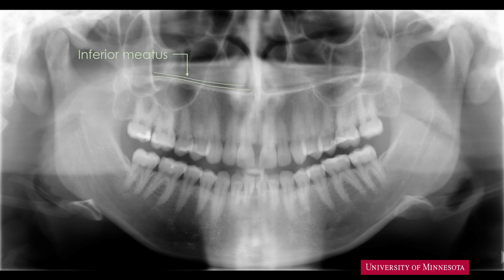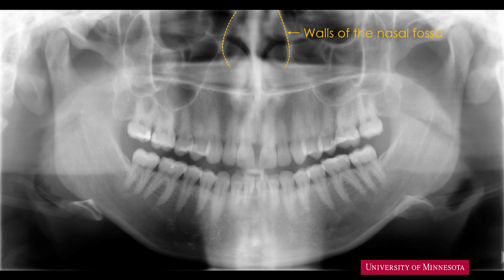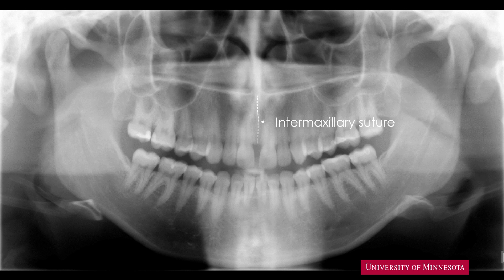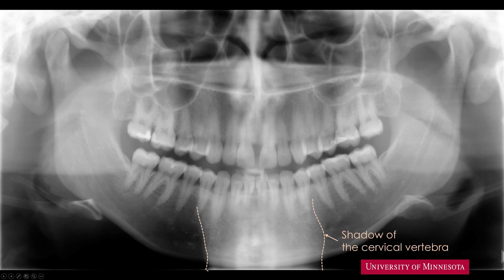Inferior to the inferior meatus is the radiopaque band representing the hard palate. On the lateral aspects of the nasal septum are curved radiopaque bands — these are the walls of the nasal fossa. You can identify faint lines of contrast superimposed over the hard palate — these are the soft tissue outlines of the nose. At the midline, there is a thin radiolucent line representing the intermaxillary suture. Superimposed over the midline of the mandible is a wide, poorly defined radiopaque band — this is the shadow of the cervical vertebra.